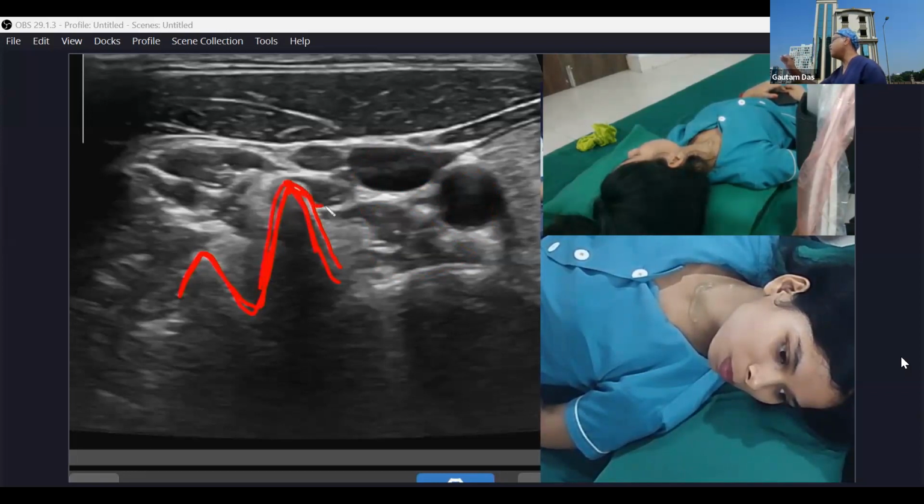And if you see the hypoechoic area, try to identify this also. That is your longus capitis muscle. You can find the longus capitis muscle from the tip; you understand this is C6. If you go down, you will no longer find the longus capitis muscle. All of the structures I'll show you one by one. Just try to identify them and don't miss this one.